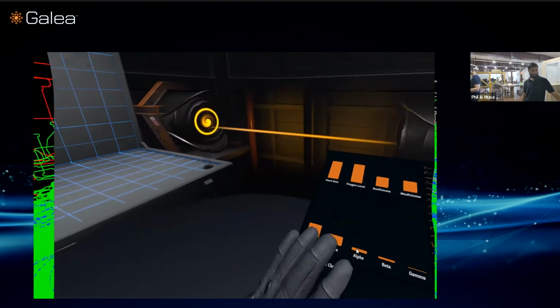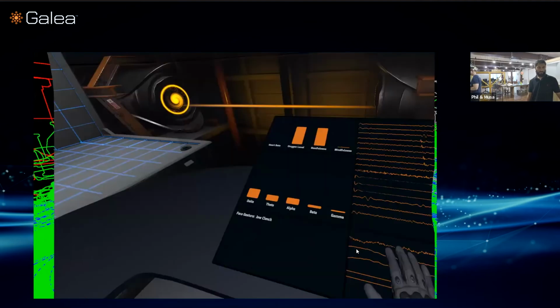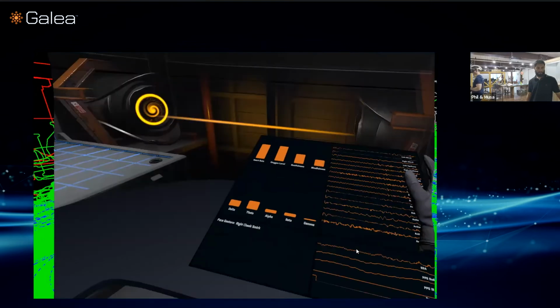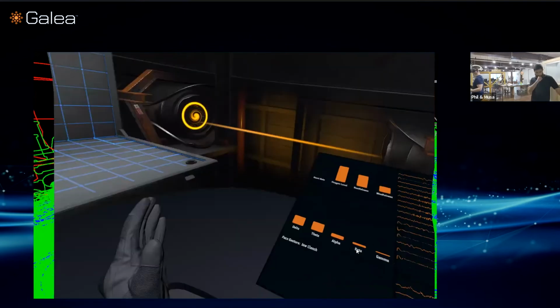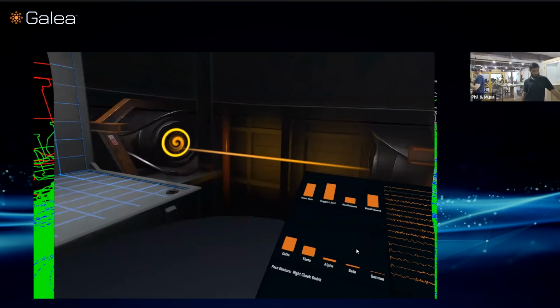I would call first derivative metrics things like heart rate, oxygen level, and average band powers, which we'll talk about in a second. They're things that can basically be derived from the raw data. Now, these first derivative metrics can also be used with each other and with other raw data signals to create second derivative metrics, or things that are even higher levels of information.